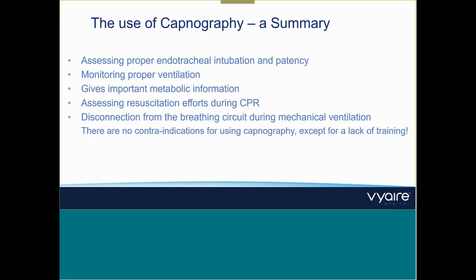And last but not least, there is really no contraindication for using capnography. None, nothing, nada. So if you're insecure using CO2, get training, look at other trainings available, read about it. Also, the IFUs of the capnometry manufacturers give you lots of hints and tips on how to use it. So there is really no contraindication for CO2. Maybe a little bit the dead space addition, but that would be the only one.